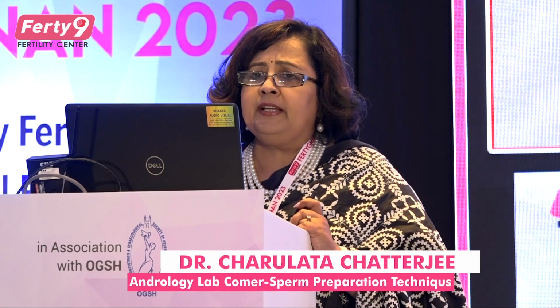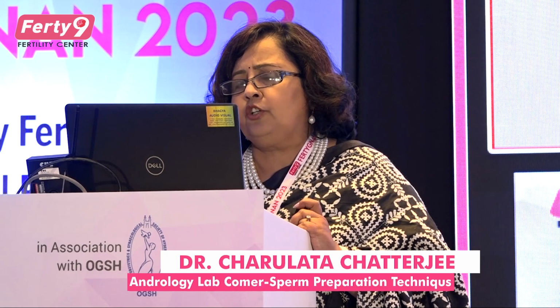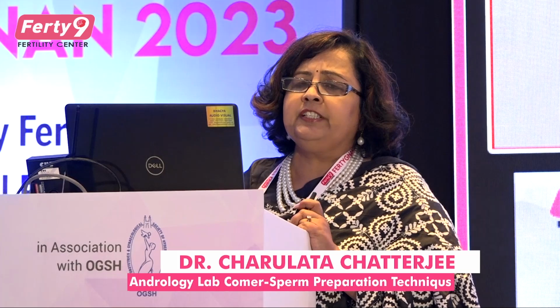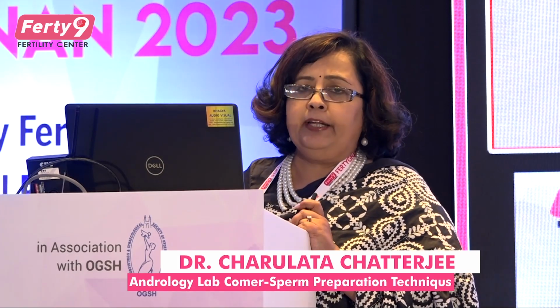So if the DFI is high, there are many techniques available. As Dr. Anusha has also told, treat a man or treat a sperm. We should do both. First, we should treat the man, and the second is to treat the sperm in the laboratory. The first is MACS, which is called magnetic activated cell sorting. Another is microfluidics.